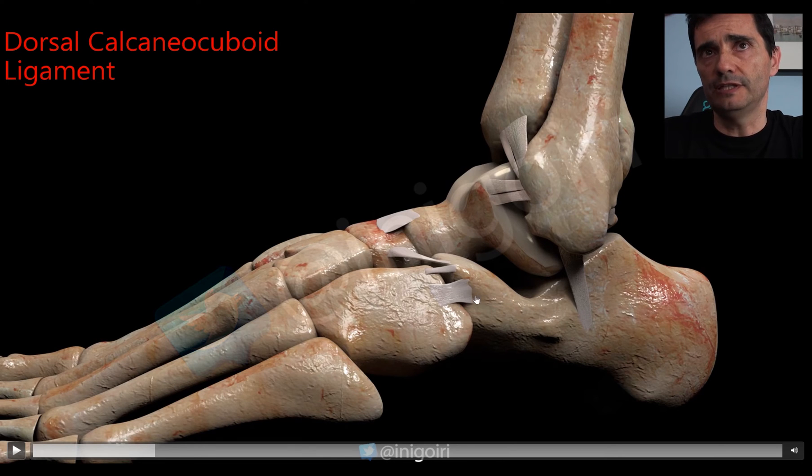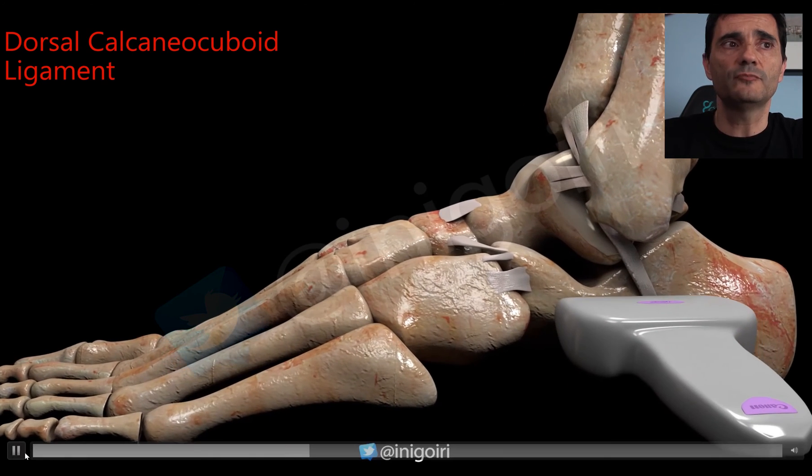There are other ligaments to check with the same mechanism of lateral sprains. We can also have the calcaneocuboid ligament and the bifurcate ligament injured in the Chopart joint. These two ligaments are very important and usually forgotten. If the patient complains of more anterior pain — not at the ATFL location but distally and inferiorly — always check these ligaments. They can be very well visualized with high-resolution ultrasound, and are sometimes difficult to see by MRI.